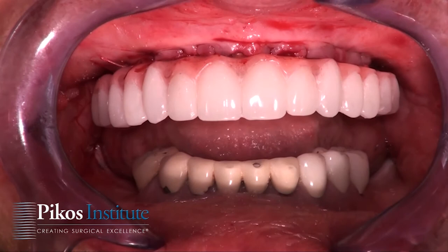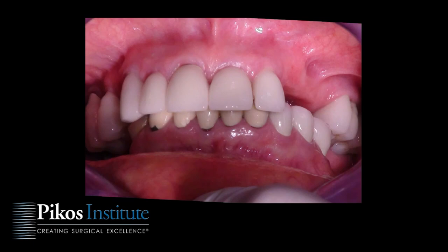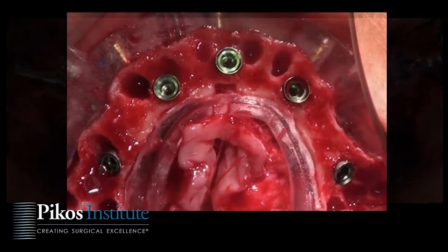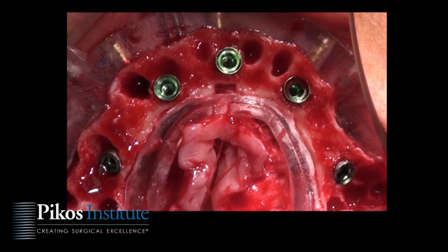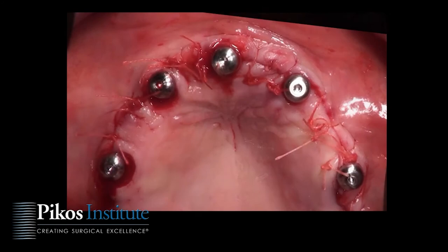We utilize a dual-cure flowable composite for this step. The lower arch will be addressed at a later date — this patient, due to finances, can only afford one arch for now. To summarize: we extracted teeth, placed implants with our foundation guide, seated multi-abutments, placed the copings and gasket with the prosthesis, and in the interim grafted as shown. There is the provisional prosthesis in place.